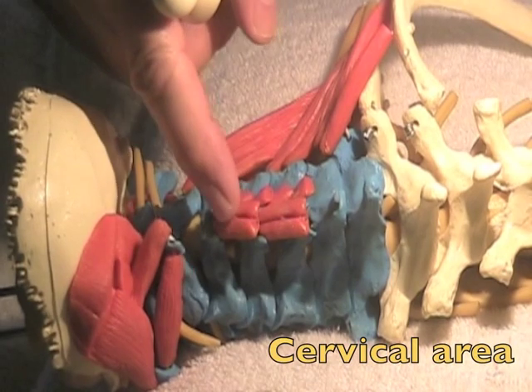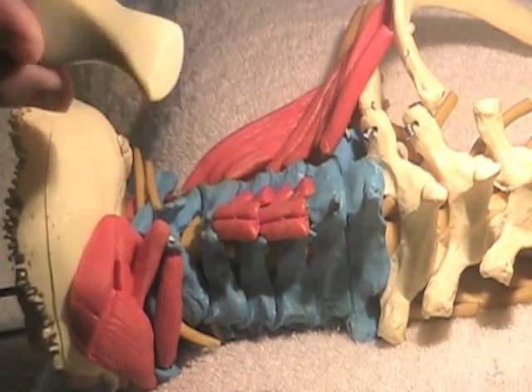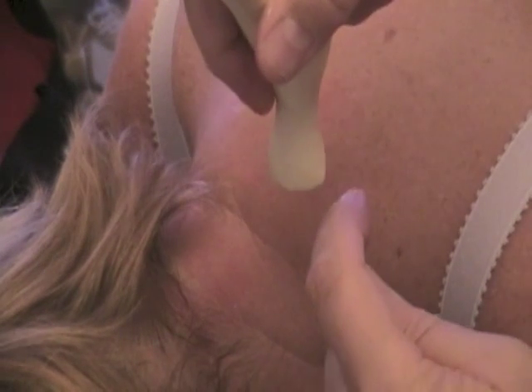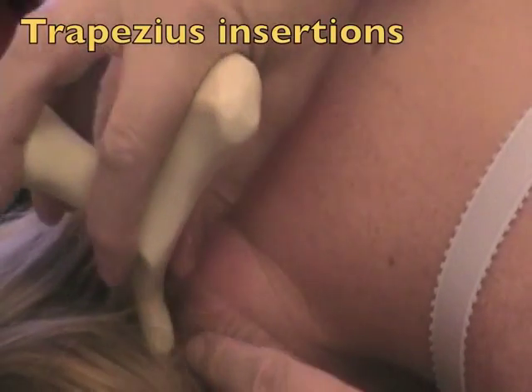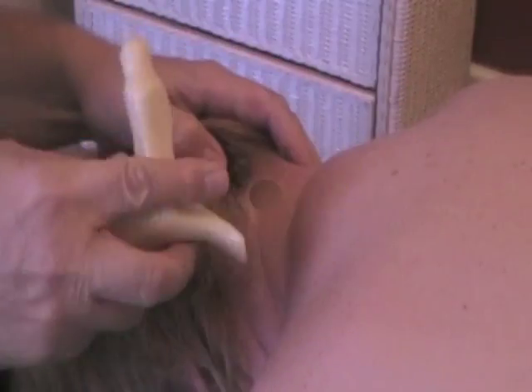Here you can see on the model the little muscles that run from spinous process to spinous process. The little tool is just fantastic for getting in and releasing those. Because of the shape of this tool, as you come to a tight muscle, it will slip up and over any tight muscle. I can also use the flat edge of this tool to work the insertions on the occiput of the trapezius.